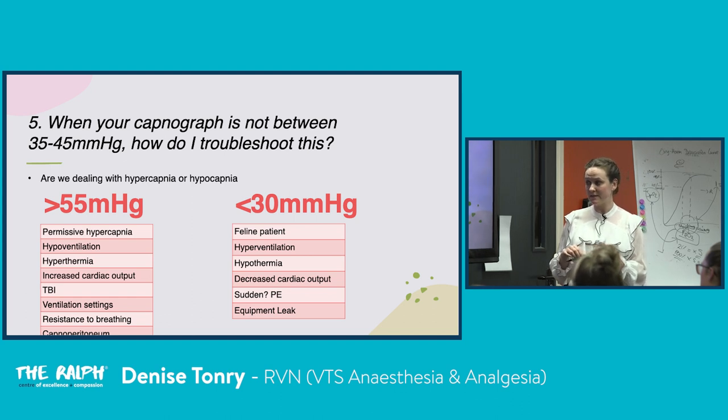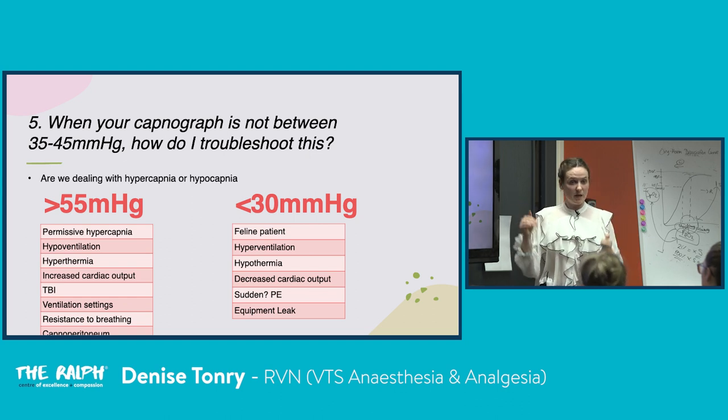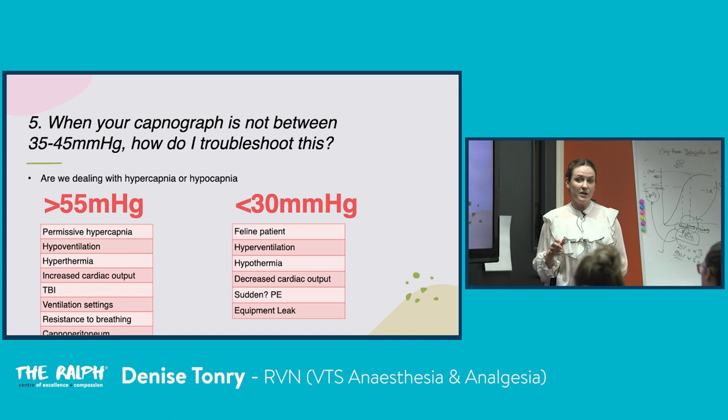Resistance to breathing, this is a classic one for brachycephalics. They have a massive resistance to breathing, huge intrathoracic pressure. And very often when we anaesthetize them, the first end tidal reading you get is 55, 60. And often you are inclined to IPPV them and bring down that carbon dioxide. There is a very possible situation that they can tolerate that. Their end tidal is probably higher when they're conscious. So they've actually shifted their response curve.